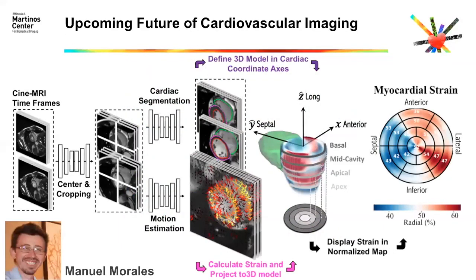There is a PhD student in our lab who is actually using motion, but not from the brain, from the heart, because I was telling you that I'm using a lot of cardiovascular applications. In this case, using the MR motion from the MR images to derive cardiac function, and using that now to get into the PET images and correct PET images for cardiac motion. This is what his next step is going through.